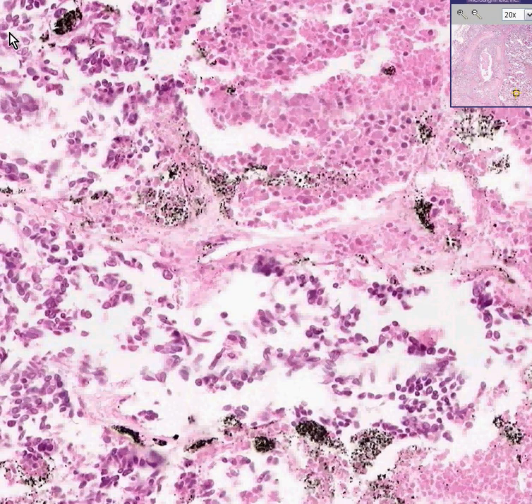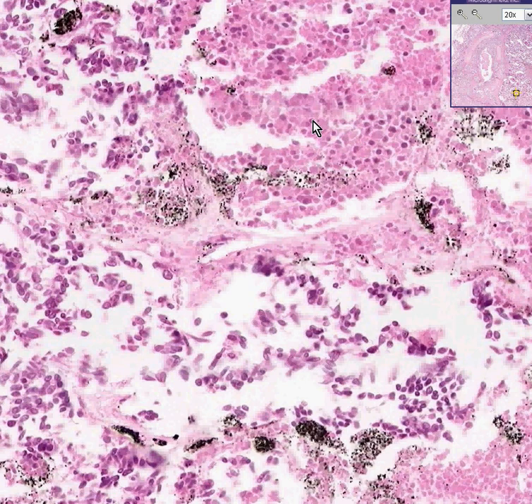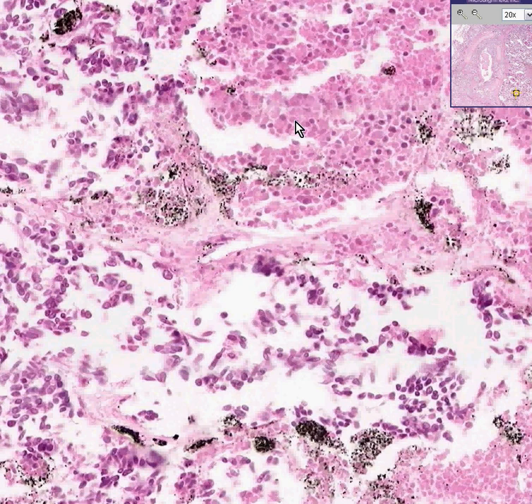But look at these tumor cells — they're necrotic tumor cells. Do you see how good and sharp the differentiation is here between tumor nuclei and their minimal cytoplasm? Well, look — it's all kind of a granular crud here, and some of these nuclei look like they're either poorly visible or all gone. This is necrosis. Oat cell carcinomas grow so fast that they frequently are necrotic, in which you could just see ghosts of nuclei. That's what they call the ghosting effect.